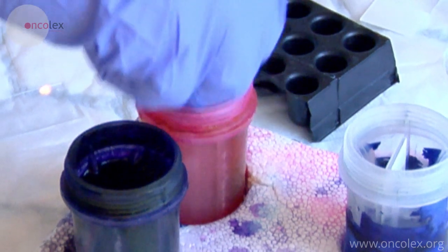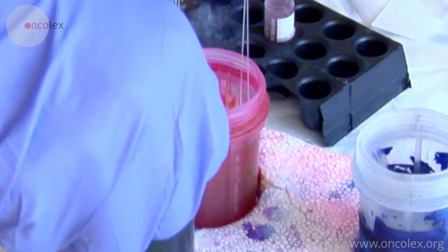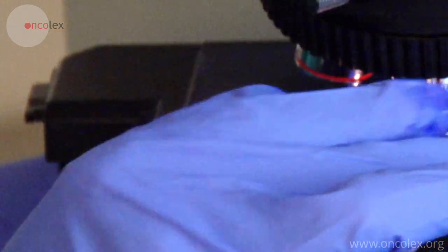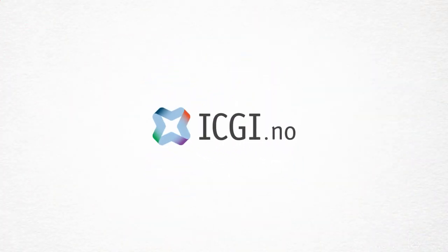The test material is stained with a rapid stain and immediately examined under a microscope by a pathologist. He controls that there is sufficient material from the lymph node for an analysis.